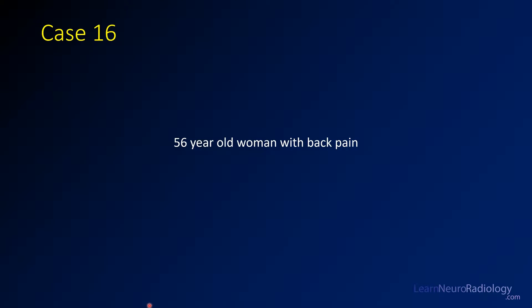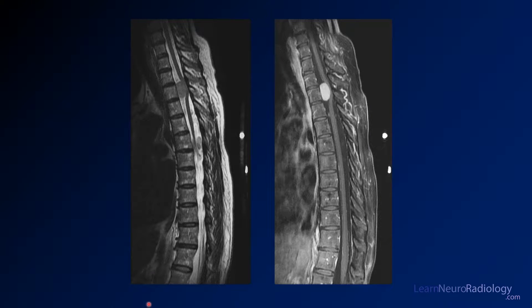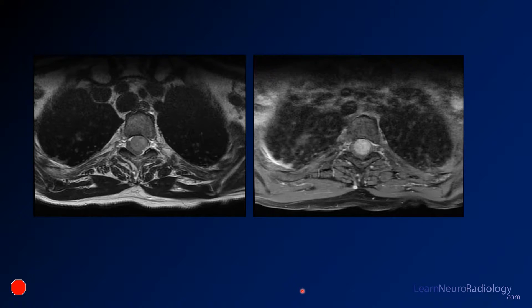For this case we have a 56-year-old woman with back pain. Here you see two sagittal images from an MRI of the thoracic spine. We have a T2 and this is a post-contrast here. Here you see some axial images through the same region. This is a T1 pre-contrast and a T1 post-contrast with fat saturation.